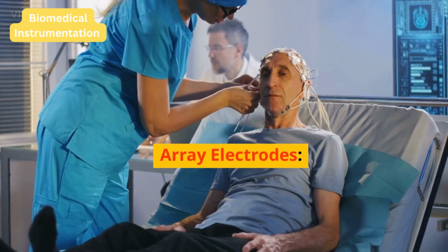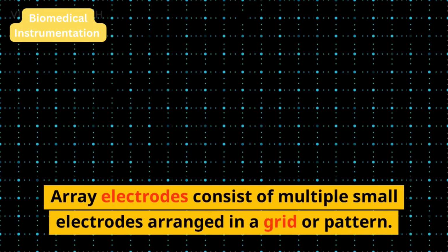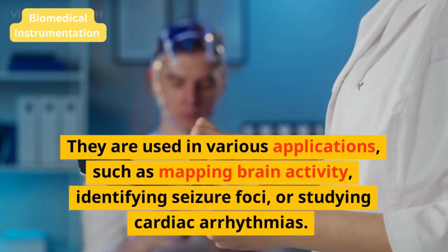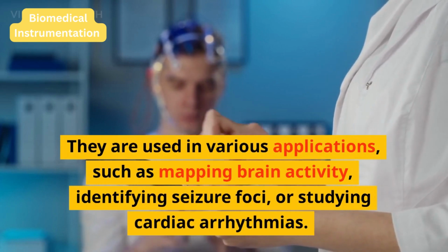Array electrodes. Array electrodes consist of multiple small electrodes arranged in a grid or pattern. They are used in various applications, such as mapping brain activity, identifying seizure foci, or studying cardiac arrhythmias.